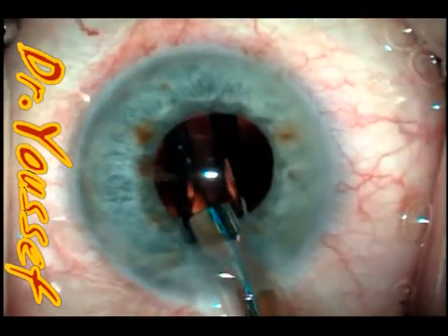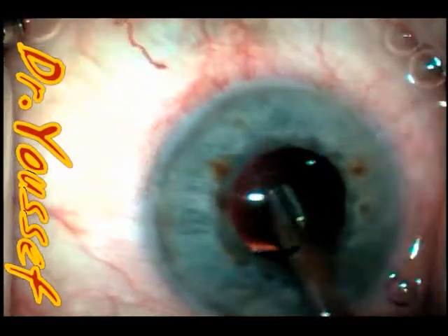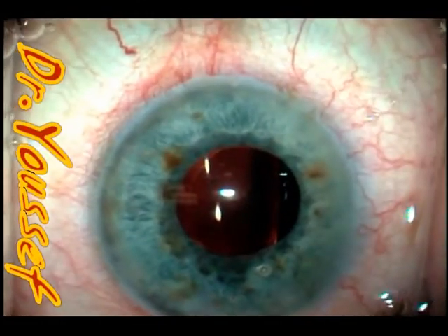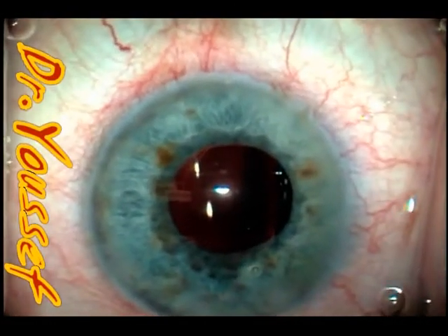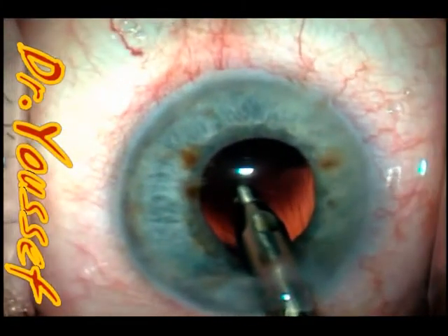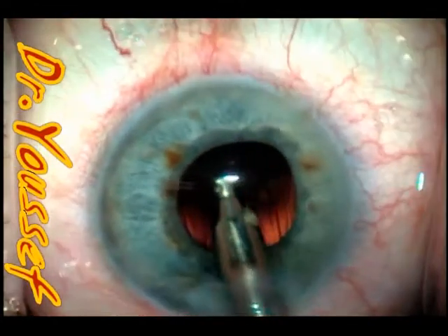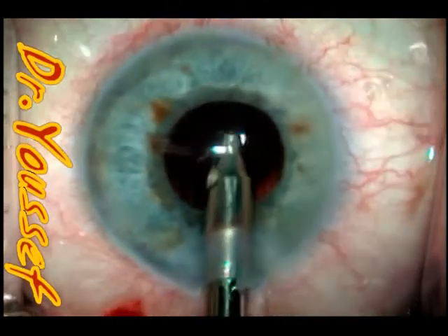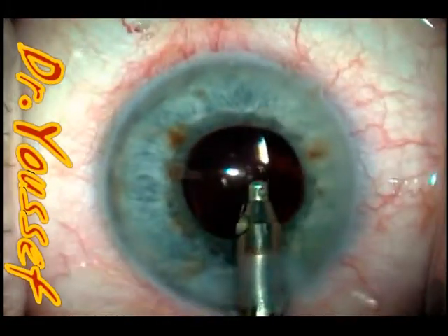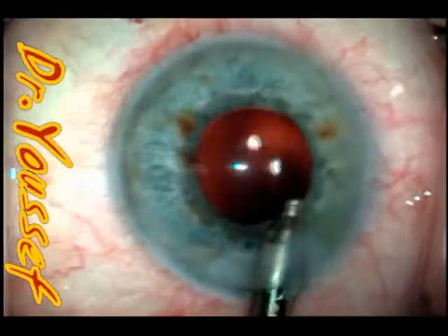You have to be extra careful with lens implantation, because sometimes we put a lot of stress on the zonules — underestimating how much — and I've had quite a few cases with small dialysis at this stage with pseudoexfoliation. If you have a problem implanting it in one stage, take your time and use a Sinskey hook so as not to stress the zonules. The most important thing in these cases is not to stress the zonules. Now I'm doing a cortical cleanup using the IA — now that the lens is in place the capsule is protected, I can use high vacuum with no risk of capturing the capsule. By delaying irrigation-aspiration until the end, after the lens is in, you avoid posterior capsule tears.